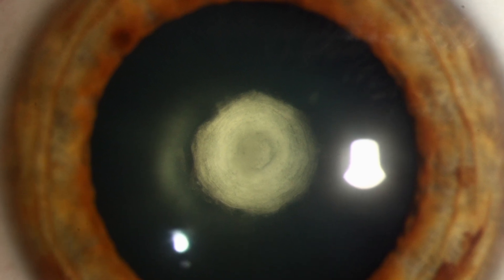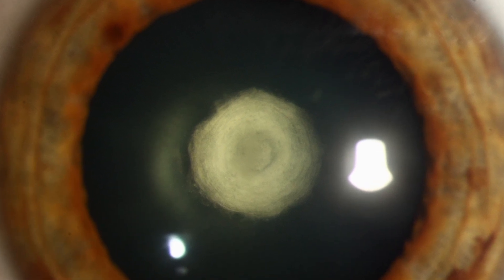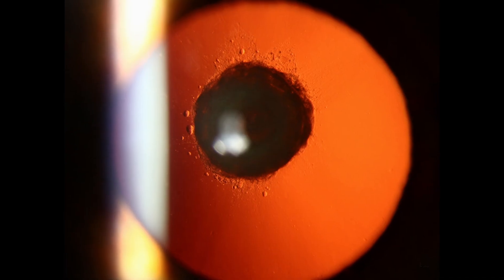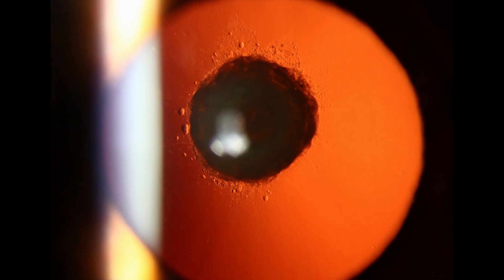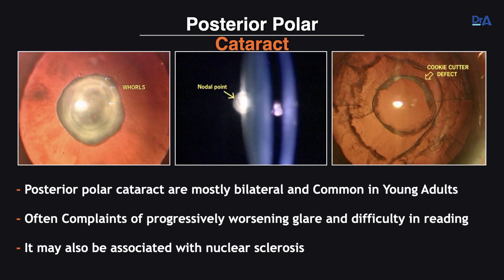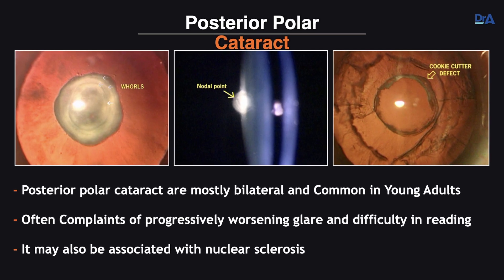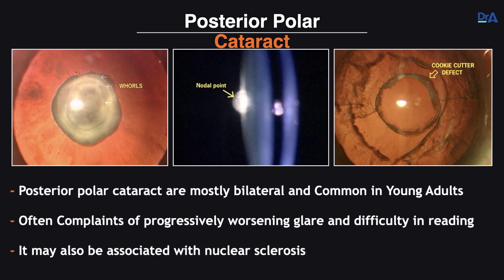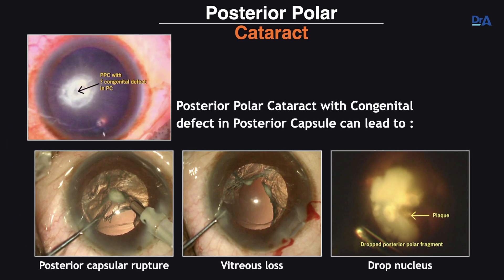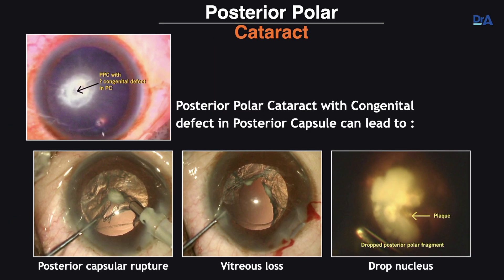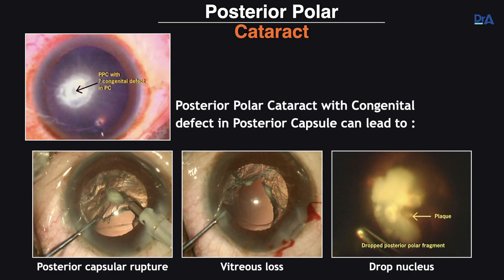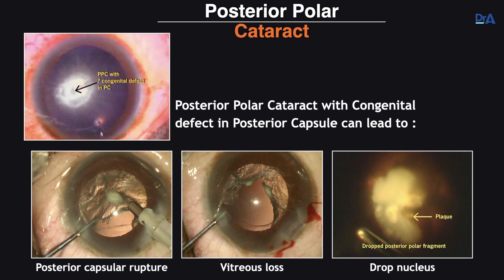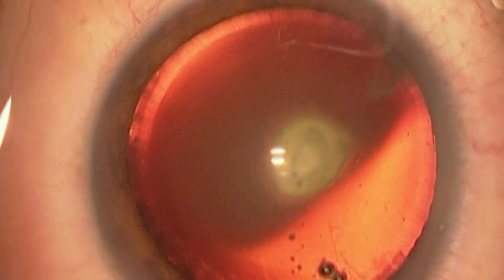Posterior polar cataracts are unique. They could either be adherent to the posterior capsule or have a pre-existing posterior capsular defect, thereby carrying a high risk of intraoperative posterior capsular rupture and vitreous loss. In this video we are going to show you the do's and don'ts of managing a PPC.